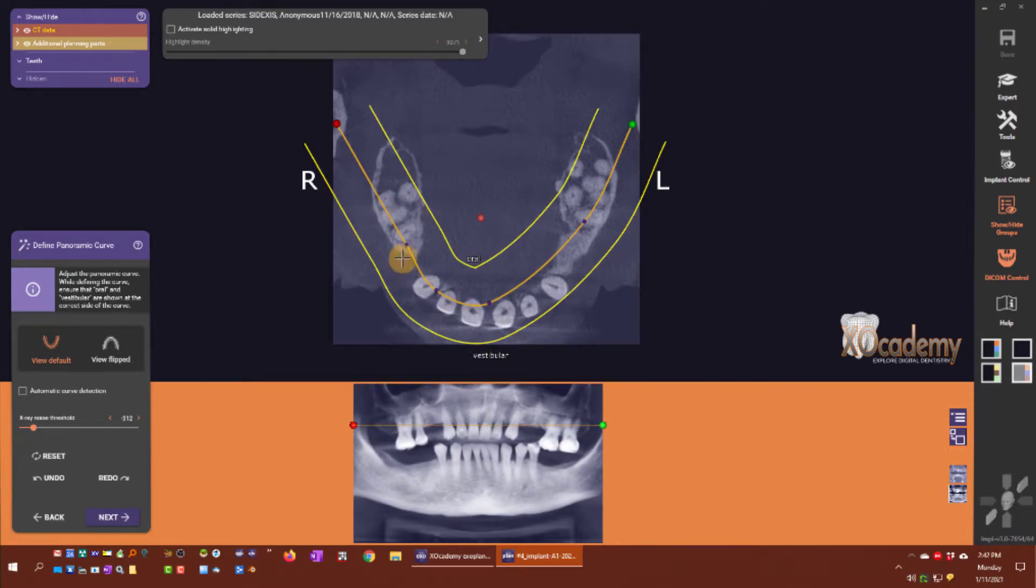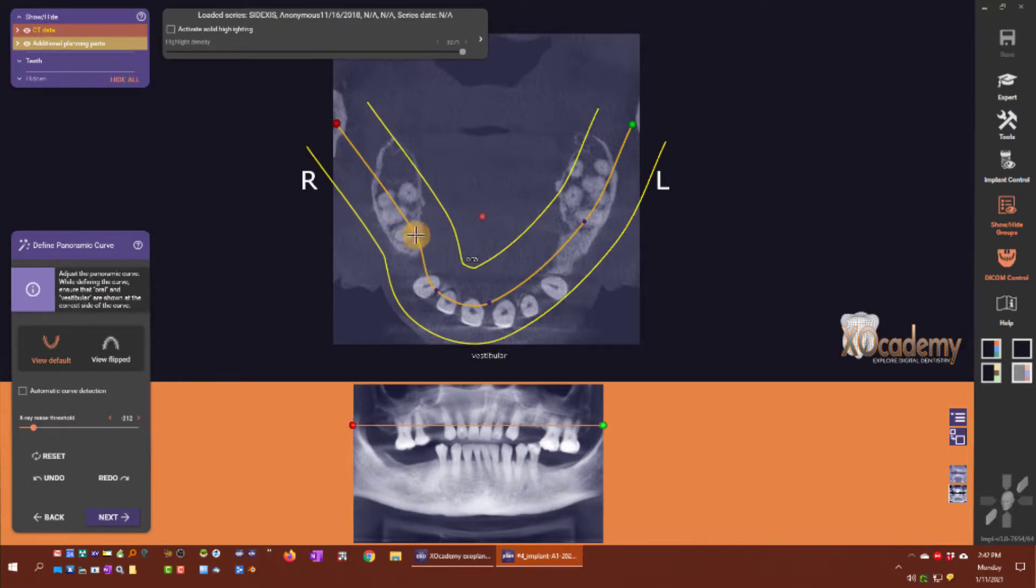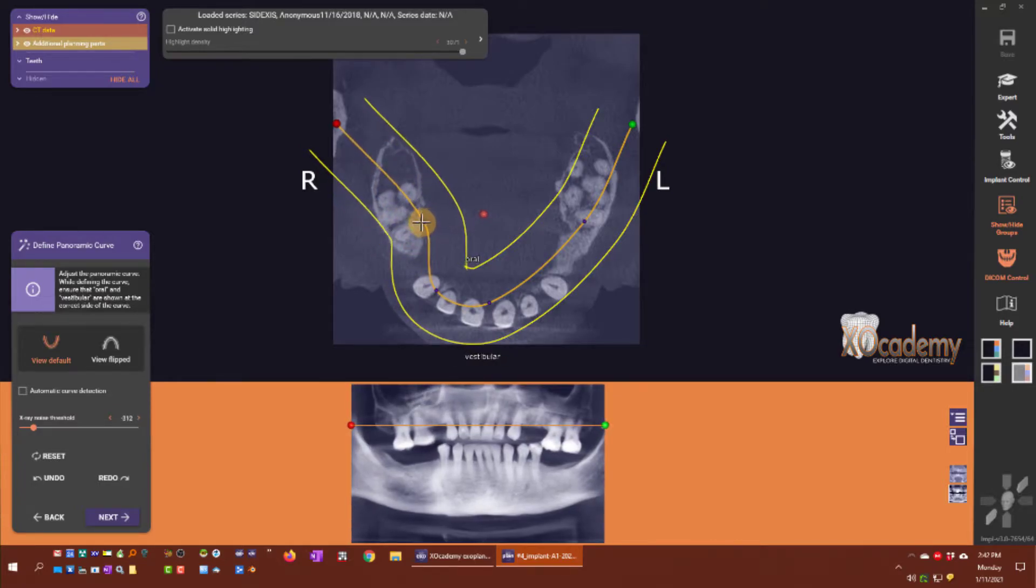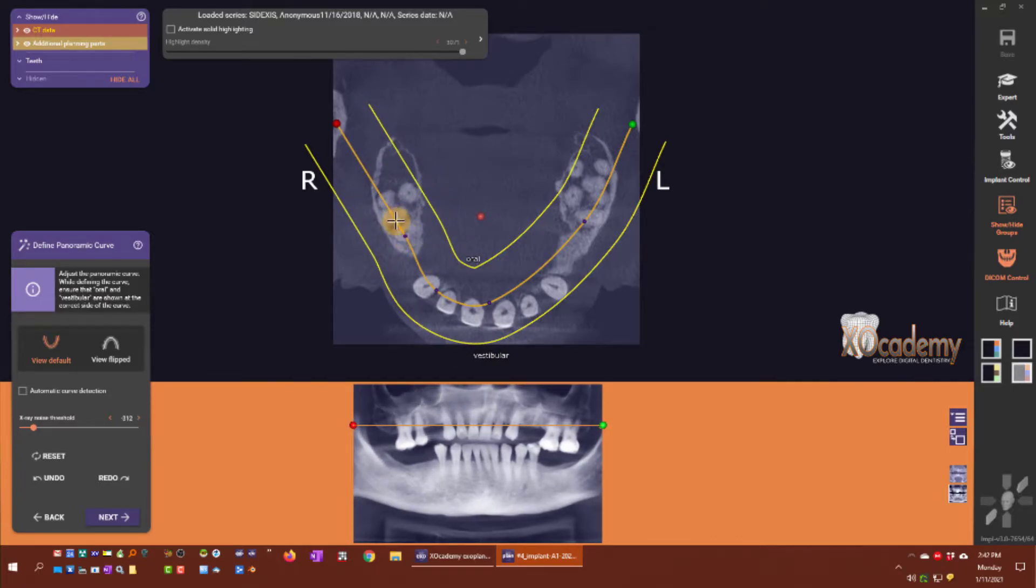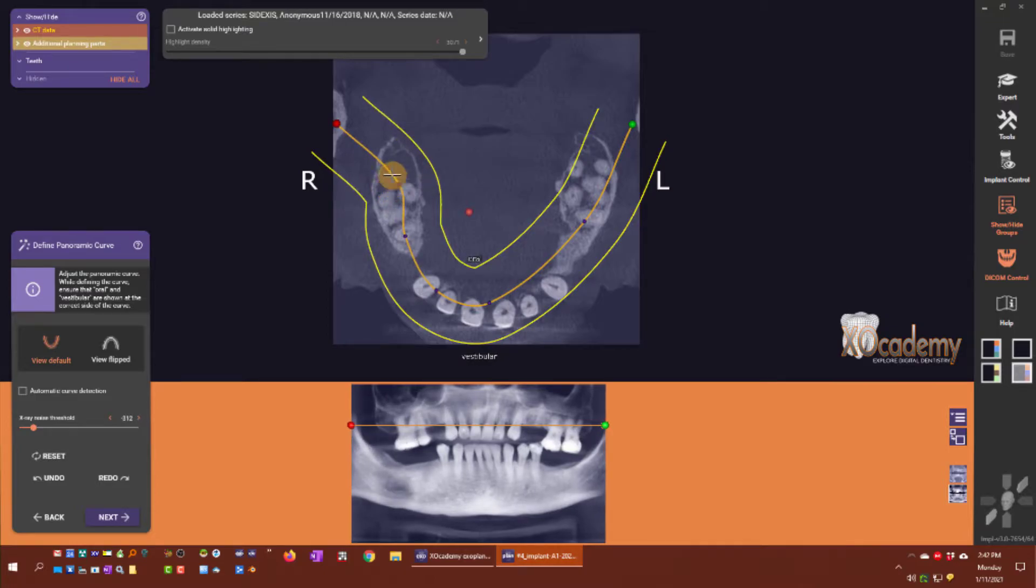I can hover over any of the existing purple points and move that curve however I need for an acceptable panoramic composite.